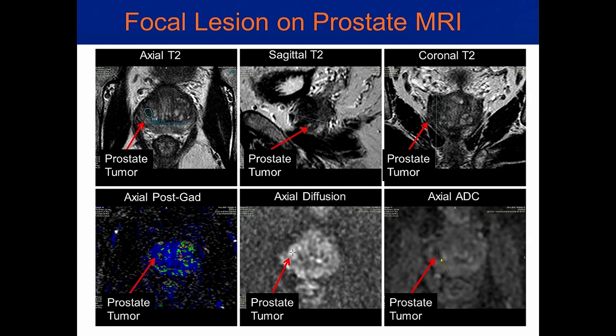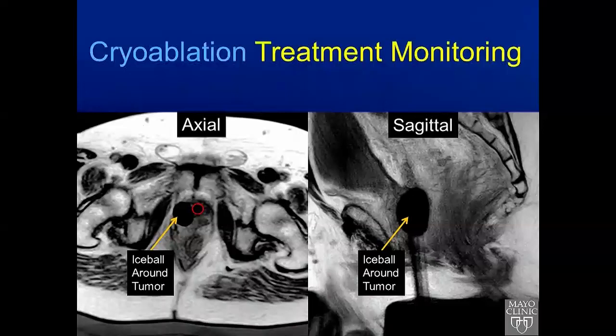Here we have the MR images demonstrating a focal lesion in the right side of the prostate, demonstrated by the arrow on the top images on T2 imaging in multiple planes. On the bottom images we see there is contrast enhancement, but we can also see this tumor with the specialized imaging of diffusion, where the tumor characteristics cause a limited water oscillation and it becomes visible on imaging.